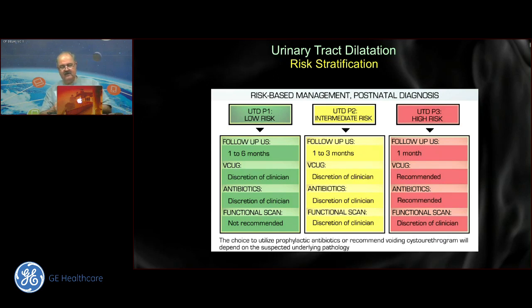When do you call back a pregnant patient for a follow-up ultrasound if she has pyelectasis at 21 weeks? At 21 weeks, I will measure very carefully, and there is nothing really that I can do between 21 weeks and term. So from an NHS point of view, for instance, I don't need to call her back. We just say we will see, and we will see when the baby arrives.